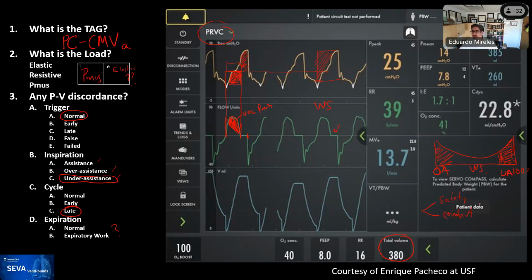So the majority of you recognize, well, do we need to do an SAT or an SBT and get this patient off the ventilator? That's great. If you're thinking safety under this circumstance, you need to know what's the cause of this, and that may be an important step.